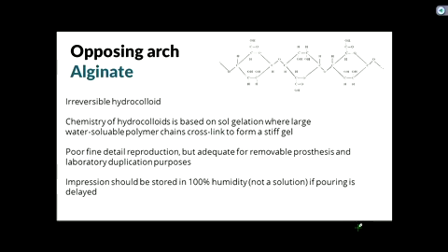It's also good enough for our opposing tooth, the one that we're going to make the crown against, in terms of knowing how to contour the tooth so that the occlusion is in kind of balance, or you've got equal contacts everywhere.